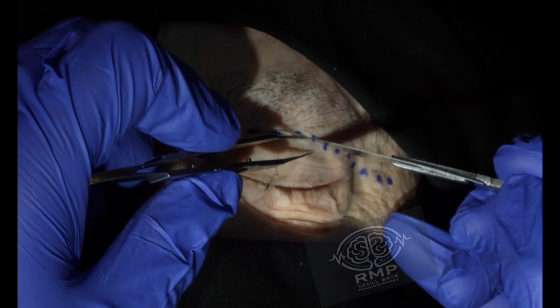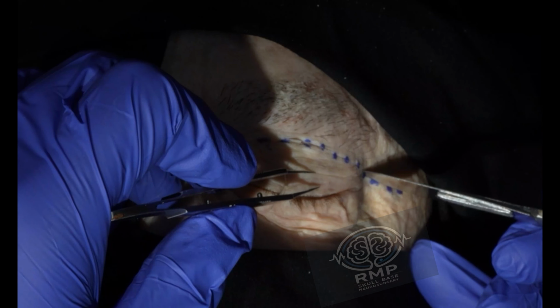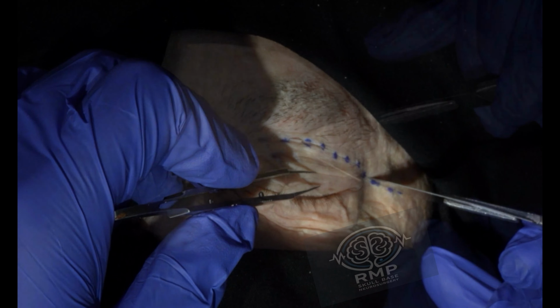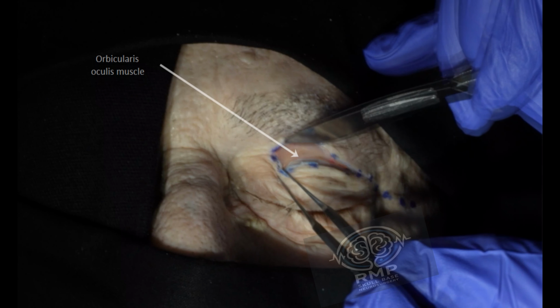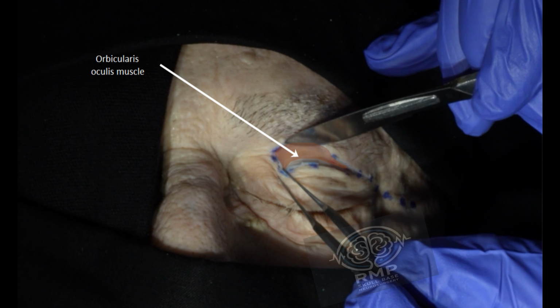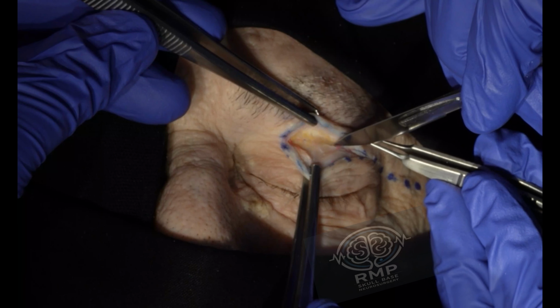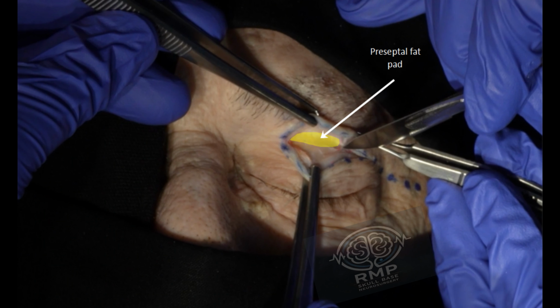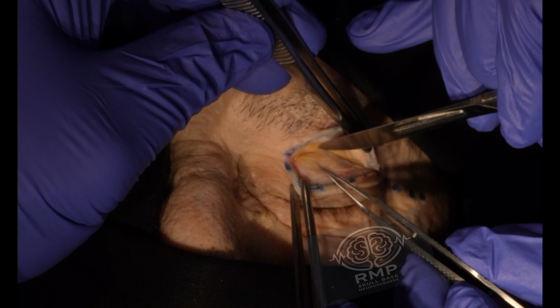After the head is positioned slightly flexed over the Mayfield head holder, an eyelid skin incision is performed over the most prominent wrinkle and extended laterally over the lateral epicanthus. Orbicularis muscle fibers are identified and severed. As you can see here, a thin layer of fat often can be found underneath the muscle, which helps in the identification of the septum palpebrae.